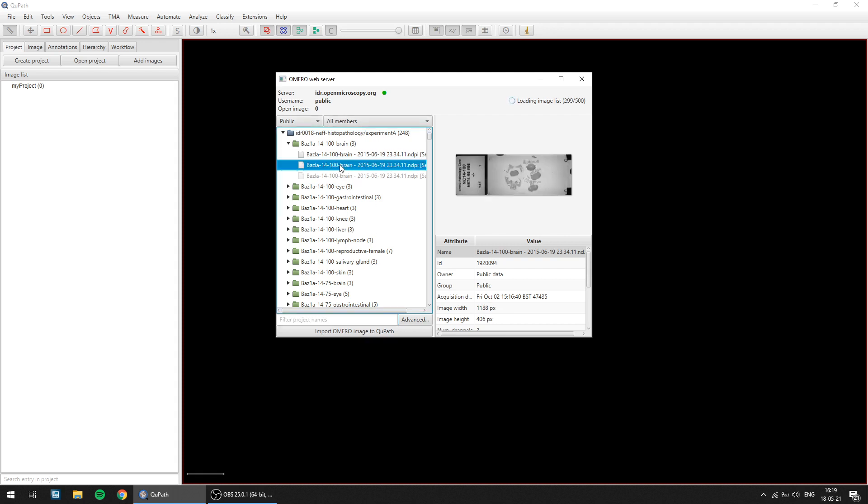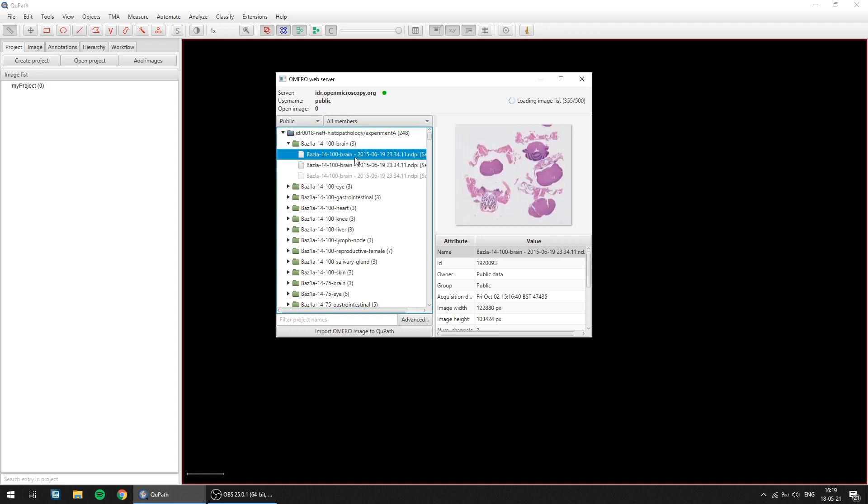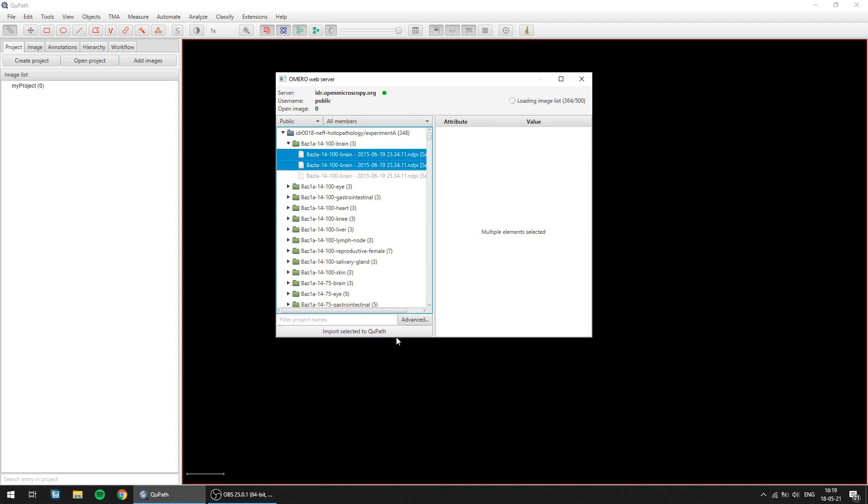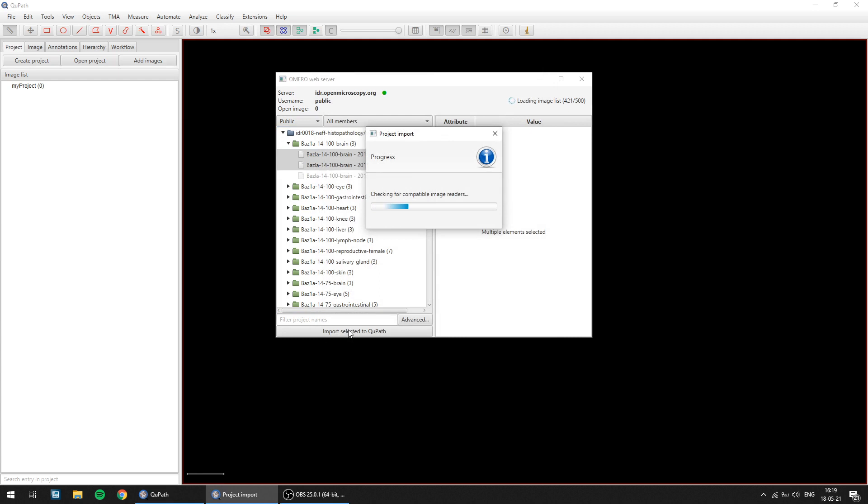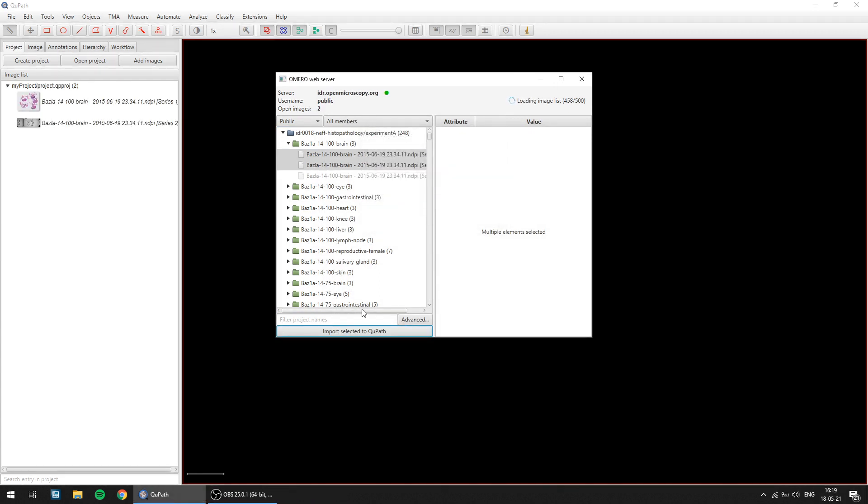And if you want to import these images into your project and further analyze them in QuPath, you can simply select them, click Import Selected, tick the relevant boxes here, click Import, and in a couple of seconds it'll just import them right directly into your project.